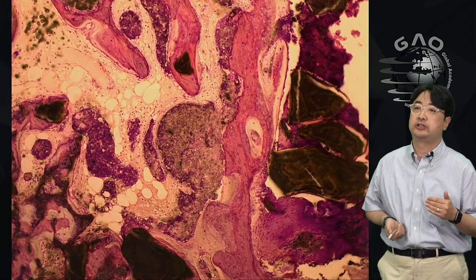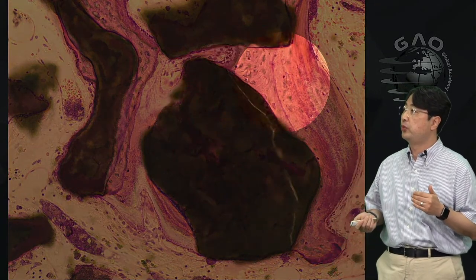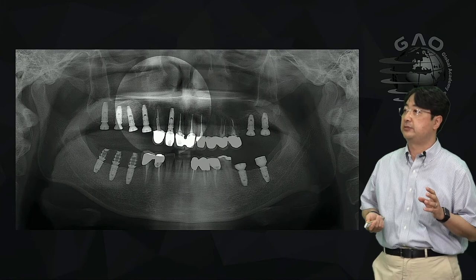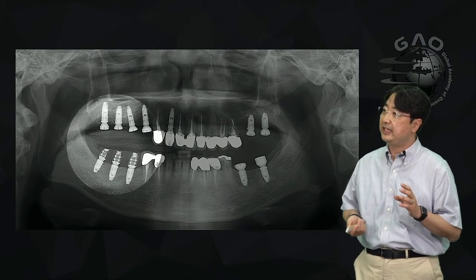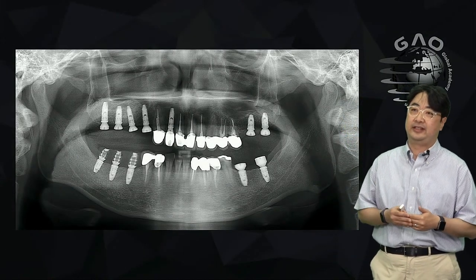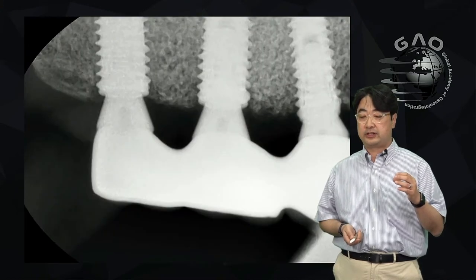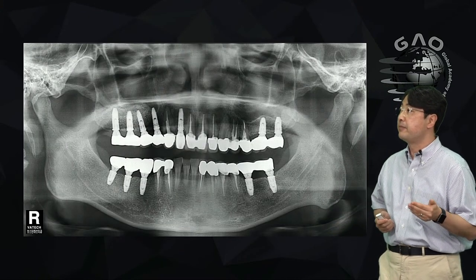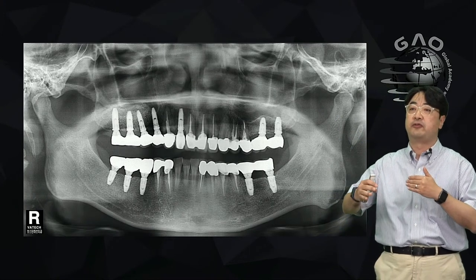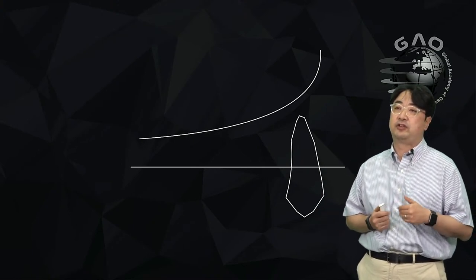And this is a histologic view of the grafted bone. As you see, alloplastic bone is black, and new bone is pink, surrounding the alloplastic material. This is a radiograph after implant placement on the right upper side. If you see this, these two posterior implants are not placed in the residual bone because he removed it, right? So, for creating space. After that, he did the final restoration for this case. Isn't it amazing that we can place and load implants in the grafted bone only because we removed the residual bone, right?